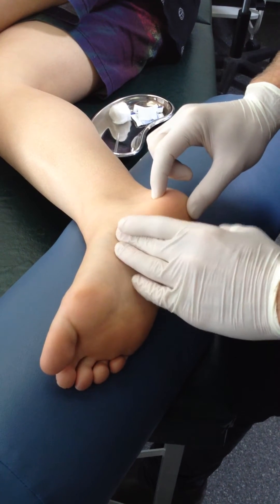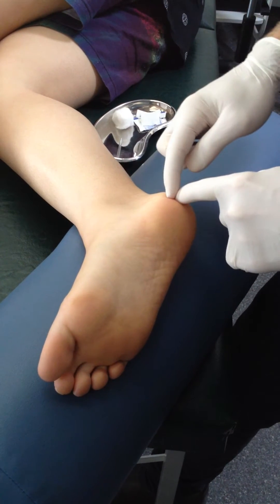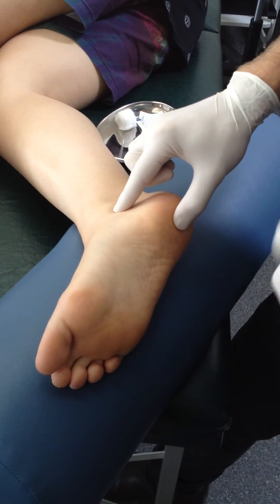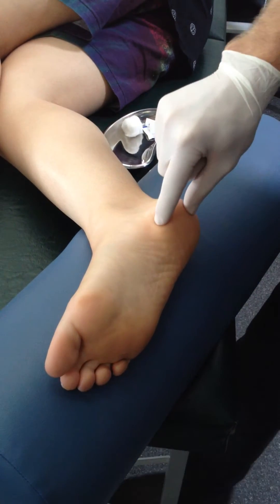Trigger points are generally in that proximal aspect of the muscle — you generally get three along here and they refer around this region. The cautions are the medial and lateral plantar nerves, which run deep to the muscle, so although we needle straight in at the calcaneus, that's an important consideration.